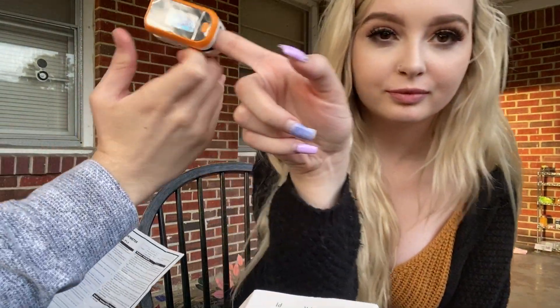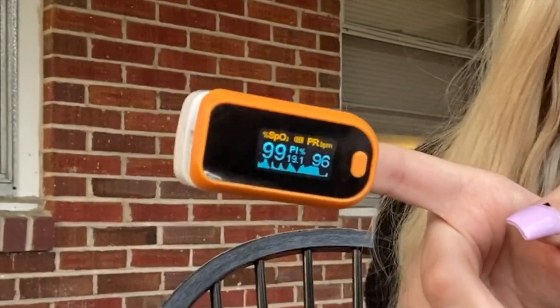This number — 96 is your pulse. Okay. It just went up from 98 to 99. Am I healthy? He says I'm healthy.